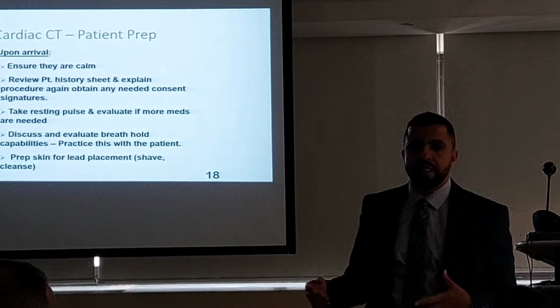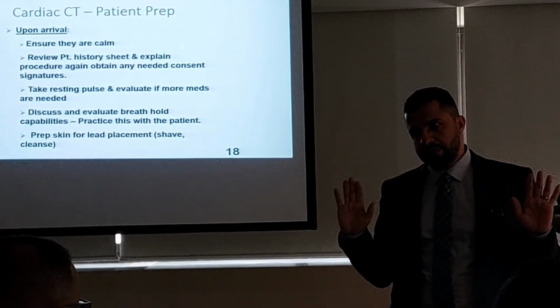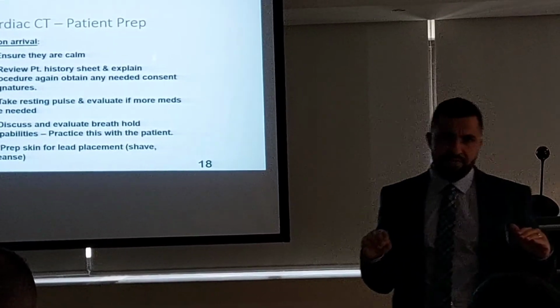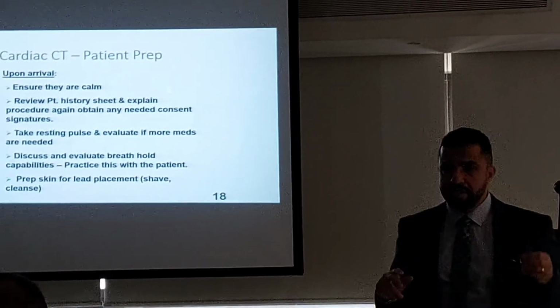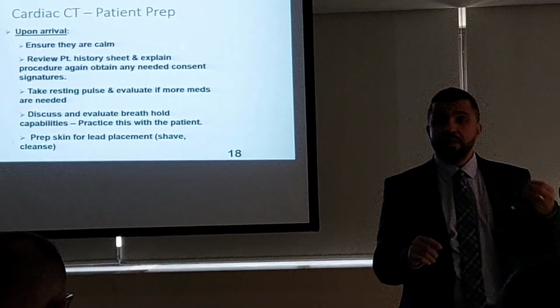So now we will go inside this procedure. I really used to say this, not with every patient. Sometimes there is no way. If he's irritated, or afraid, you will keep it simple. But some patients are keen to know, they want to know. They are educated, they read, they know what's going on. So it's very good to explain to him.